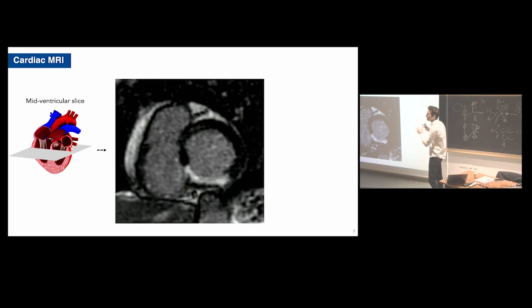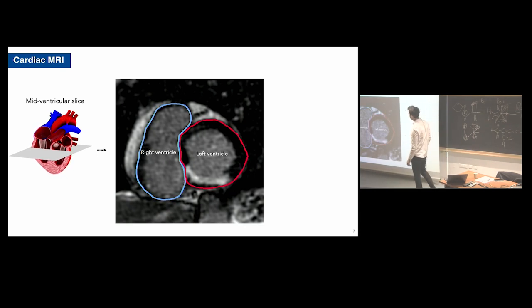But before, let me show you an image that we get with cardiac MRI. This is a short axis slice that the radiologists quite like, because we see on this image nicely the 2 ventricles. So we cut the heart in the middle, in there. It's called the short axis. On the right, the left ventricle. On the left, the right ventricle. It's very interesting, I know.